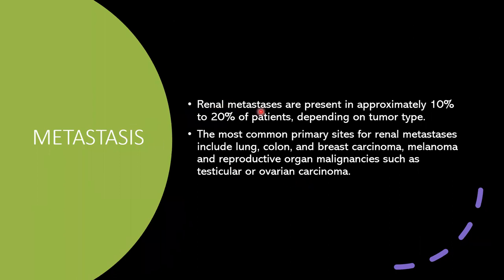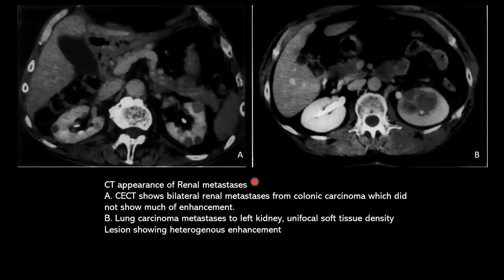Renal metastases are present in approximately 10 to 20% of patients. The most common primaries are lung, colon, breast carcinoma, melanoma, and reproductive organ malignancies such as testicular or ovarian carcinoma. CECT shows bilateral metastasis from colonic carcinoma which did not show any enhancement. This is a case of lung carcinoma metastasis to the left kidney, showing a unifocal soft tissue density lesion with heterogeneous enhancement.